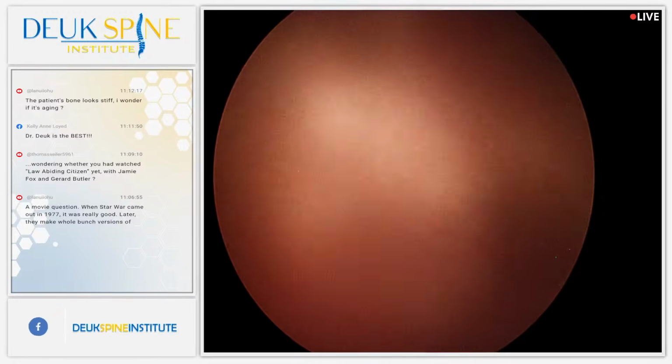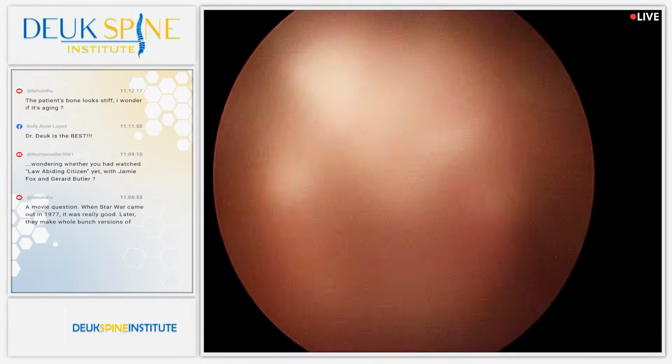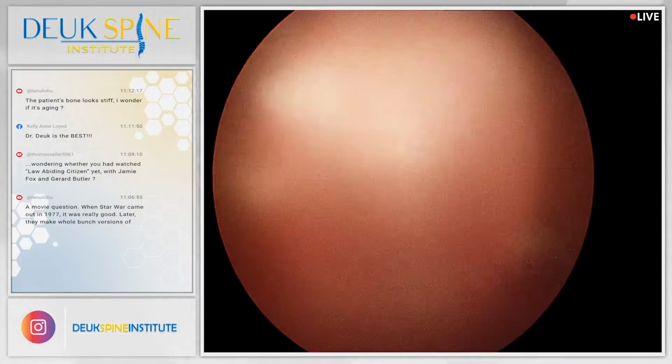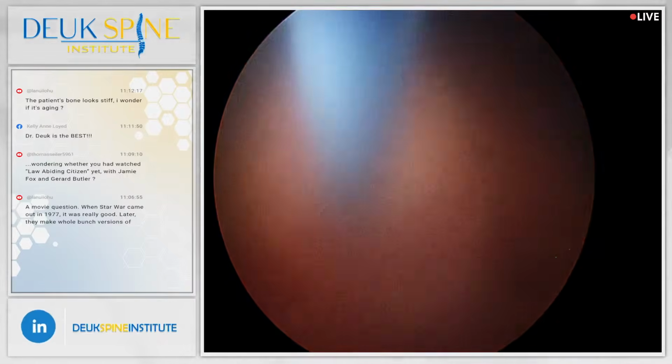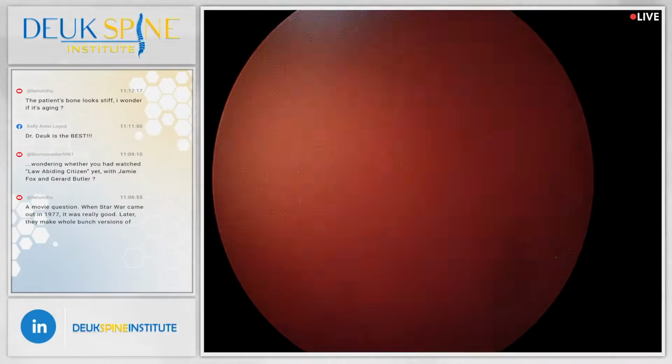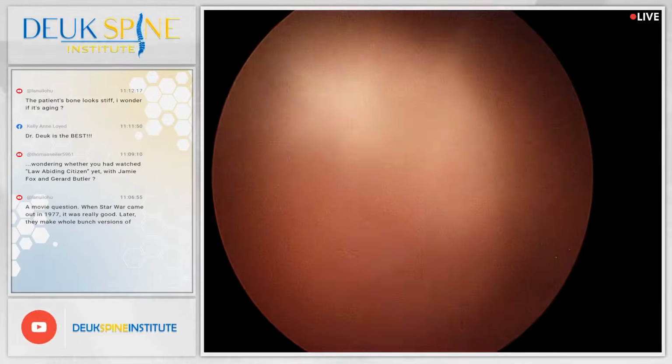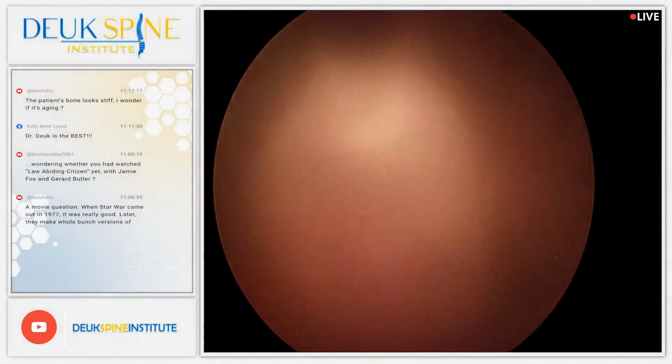All right. Making some progress here. Getting to the most painful part of the disc right here. Let's show the audience, Henry, how these disc injuries can be so painful, and how we fix them with the laser. Of course.